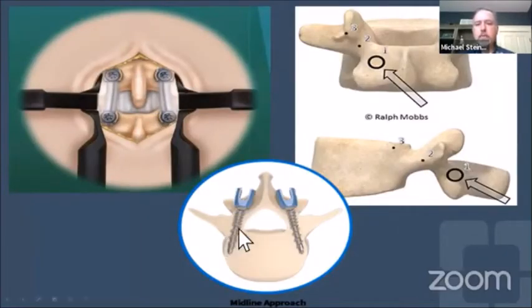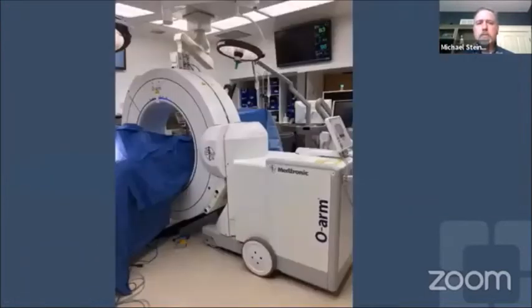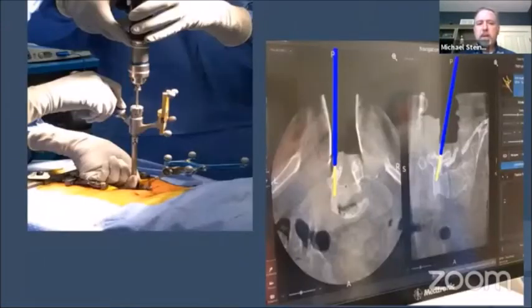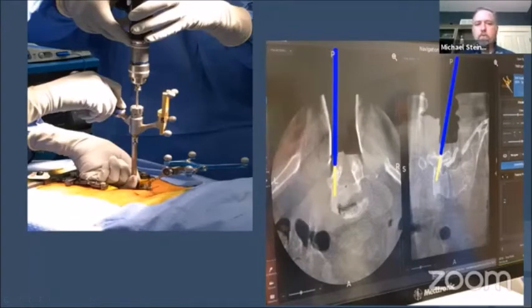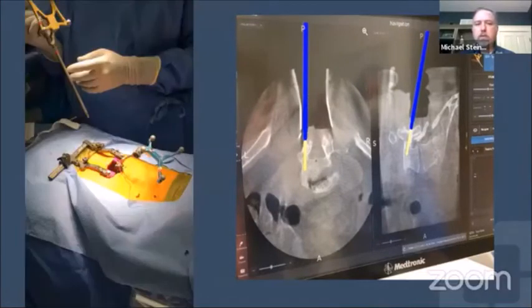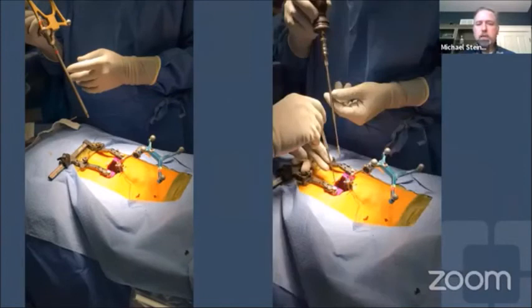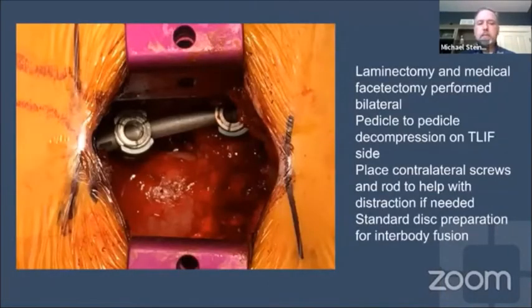The trajectory is an up-and-out trajectory, with the screw sitting in that dense cortical bone — perhaps why it behaves better in osteoporotic spine. Using image guidance, I drill to 35 millimeters, feel with a pedicle sound, and tap to full depth. I then perform a standard laminectomy and facetectomy just as in any T-lift, but through a much smaller incision.